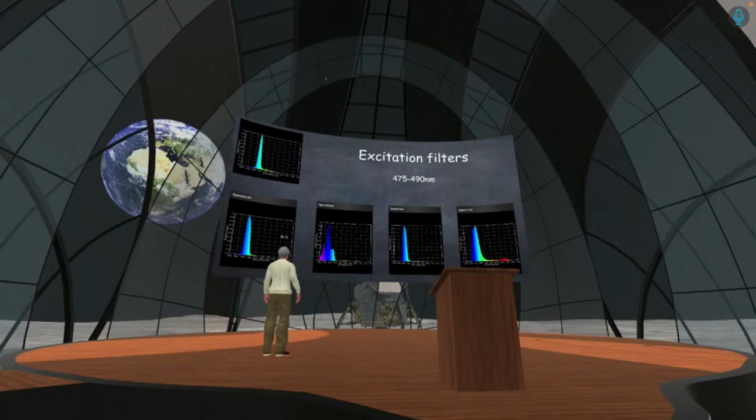In reality, it's a trial and error process until you find your best approach. But still, I want to say that if you do not have a good excitation filter, you might compromise the level of your light, and also the type of your fluorescence, hence the image that you're going to get. Next slide, please.